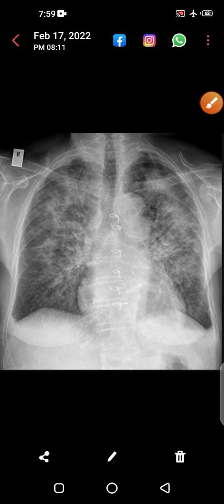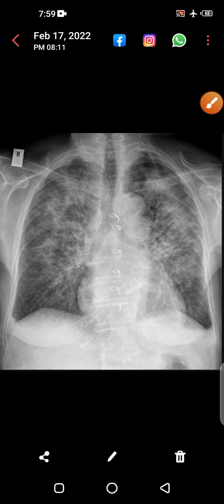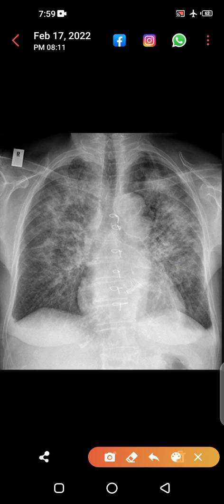Next, can you appreciate these upper lobe diversion changes and these reticulations? Upper lobe diversion with these reticulations is called the batwing sign — these are the wings of the bat. This is actually pulmonary edema. Can you also appreciate this blunting of the costophrenic angle?